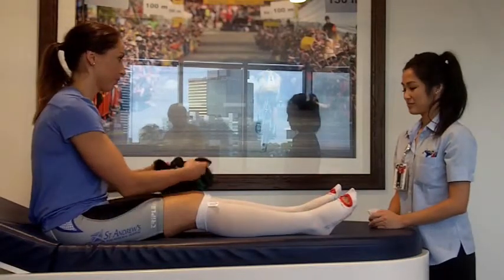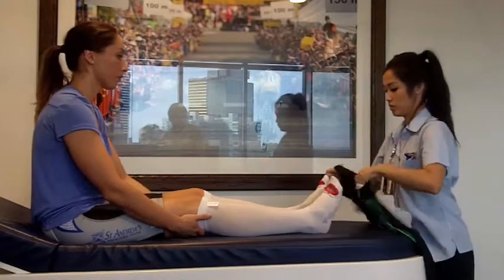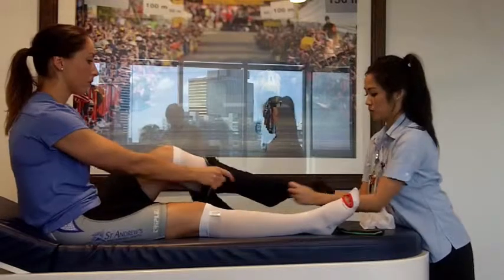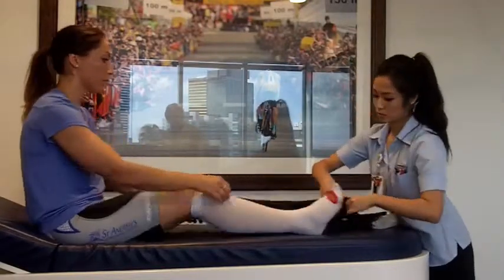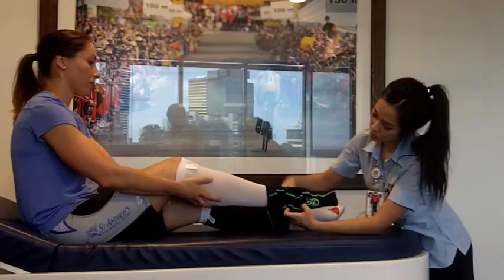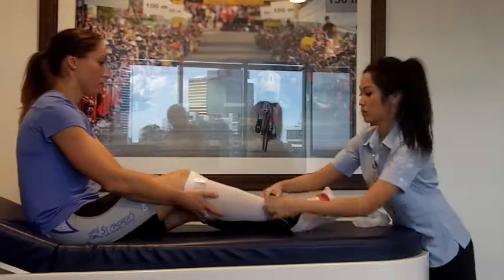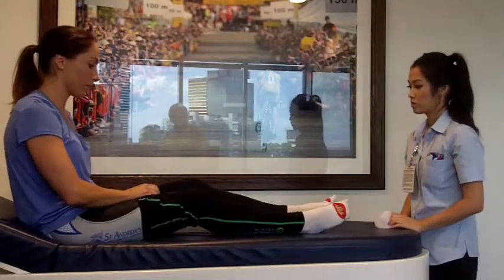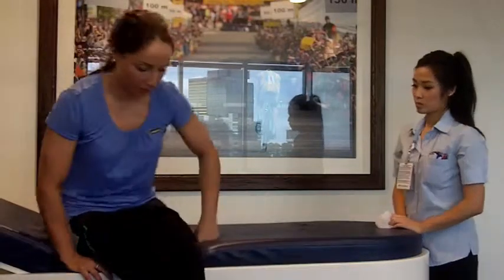Now you have to put on the skins. You'll need a hand — same position is easier — just to get them over your feet first. They should be quite firm because you want them to help reduce the swelling in your thigh and also to help prevent any clots, but this is mainly to do with the swelling and to give you support. It's important to put your affected leg in first so that you're not bending your knee up. You can buy skins from Dr. Weinerout's rooms — he has them made for you. It's up to you whether you lie back on the bed or stand up to put them on, whatever's more comfortable, but it's important that they fit properly.